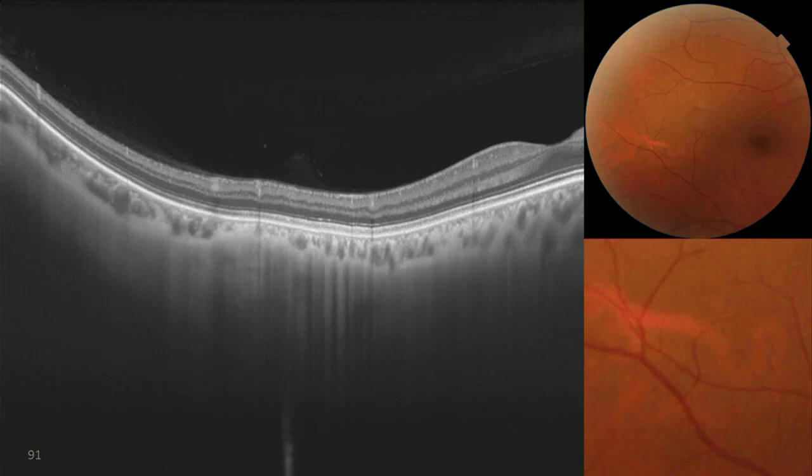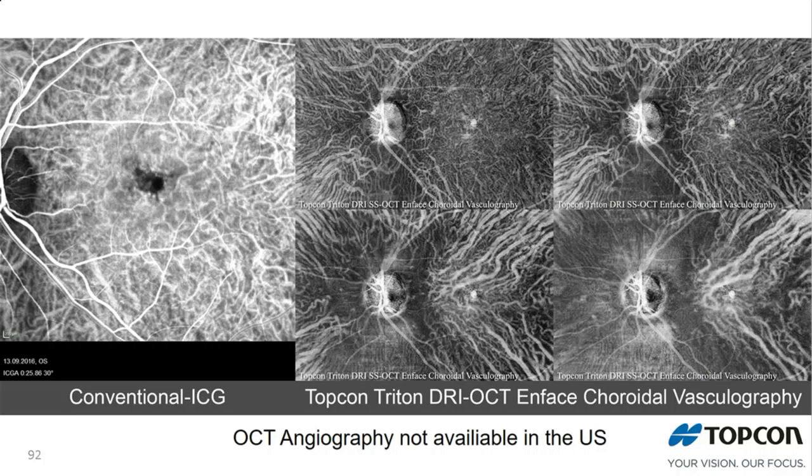Now, erythrocytes don't randomly run around. They will actually sometimes set up parallel situations inside of capillaries. If that's the truth, we don't know. We haven't shown it. But in the end, the theory is that because of this, this light gets scattered in this direction, and this light gets scattered in that direction. So it does forward scattering.